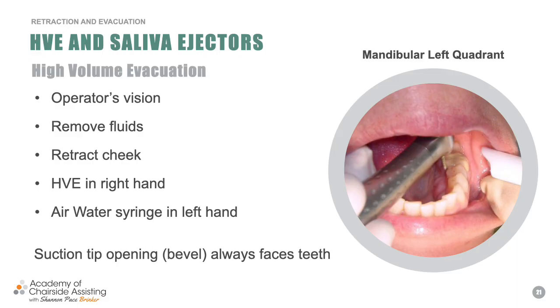The doctor knows that we can put one right underneath the tongue where he's prepping, but sometimes if that cotton roll is between the tongue and the area where they're preparing on the lingual side, they can nick it with the burr, and the patient's going to jump. The good news is it didn't cut the patient's tongue, but if that does hit the cotton roll, everybody's going to jump, right? So some doctors don't use cotton rolls on the lingual side. But if the patient is not one of those where the tongue is moving like a wild animal, you can have them lift their tongue and put that cotton roll right underneath the tongue, and it kind of keeps that tongue from moving.